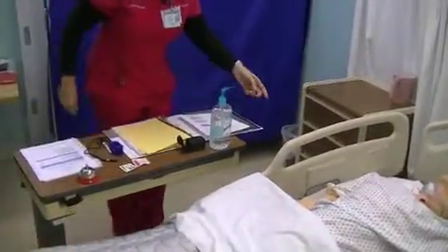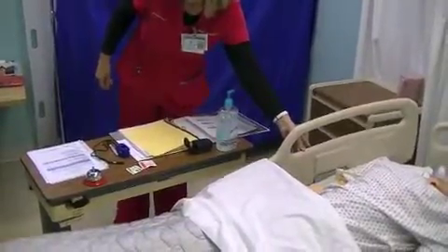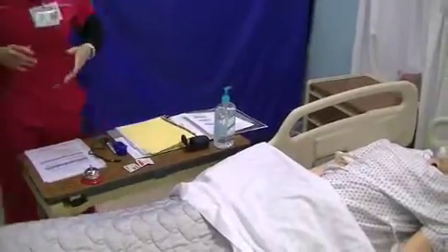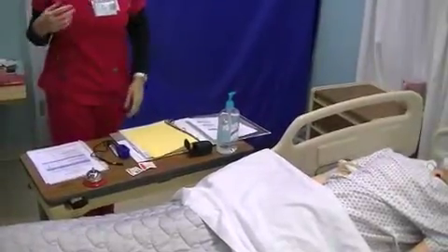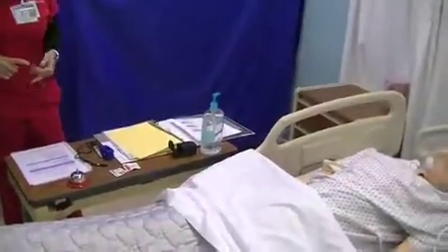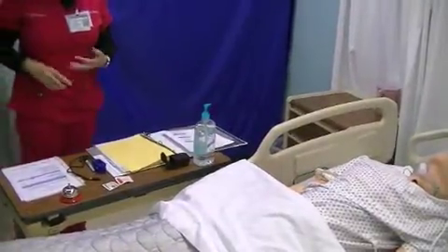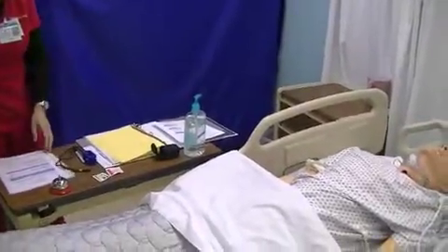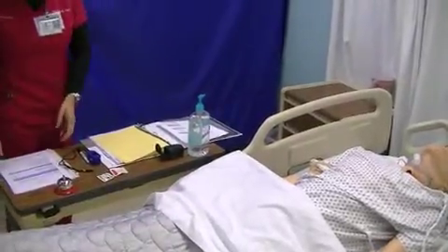So the next thing I would do is make sure that I put the bed to working height so I can take care of the patient. Now there's certain things I need to assess before. Does the patient have heart or pulmonary disease? Has he had anesthesia or is he ventilator dependent? Does he have a low hemoglobin level or confusion, or decreased level of consciousness or respiratory distress? These are indicators that the patient has oxygenation problems, and they might have pulmonary disease, which will cause O2 saturation to be lower.